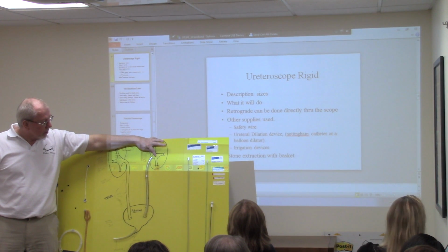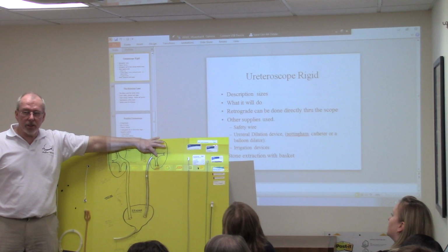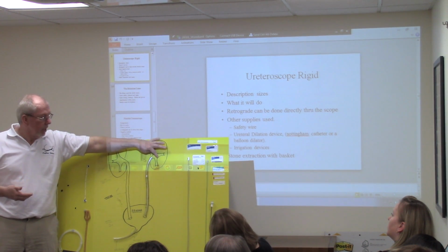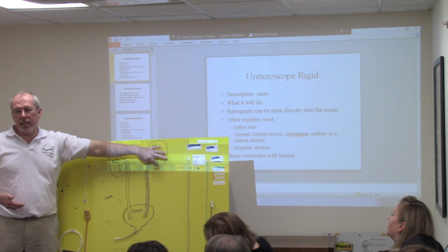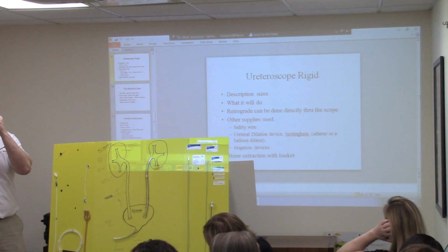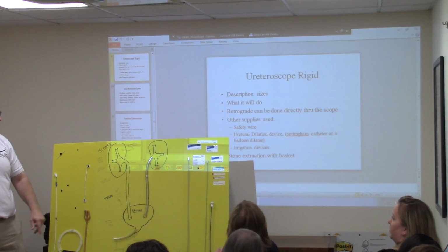So the stone, once you start shocking it, it'll tend to roll down here. And so you start shocking it and keep an eye on it. Every once in a while you watch it, and then as it rolls down, it'll eventually stop, and then you just continue hitting right there. So you have to watch it and follow it. And you move the shocking when it's at the bottom? Yeah. A little bit. Constantly.